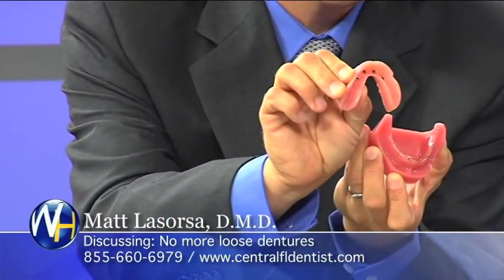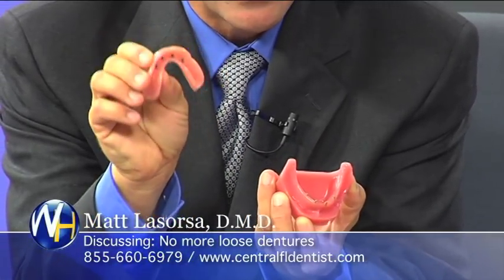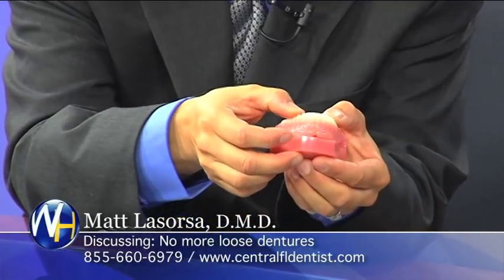Can you see that? Okay. These housings are inside the denture, and this is what snaps onto the ball of the implant. Let's take a look. So is this how snug it'll be? This is absolutely how it'll be. You can try this on. Very nice.